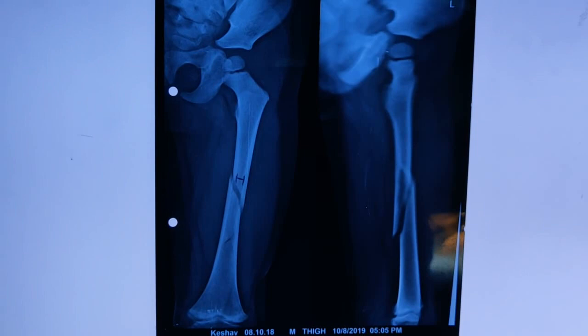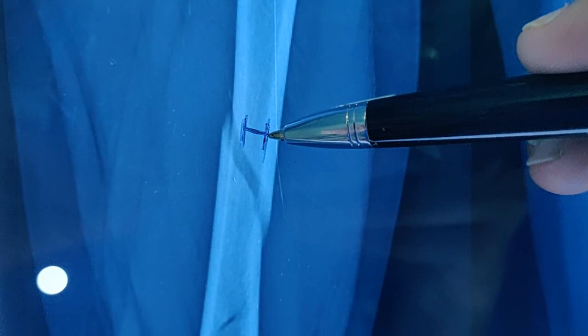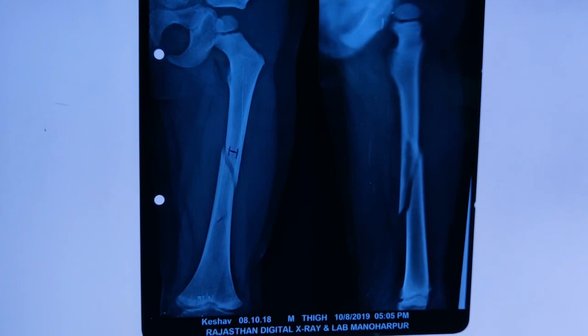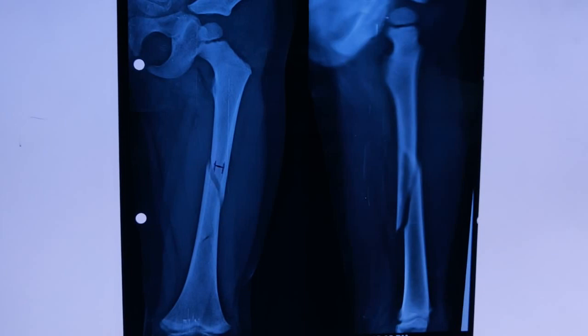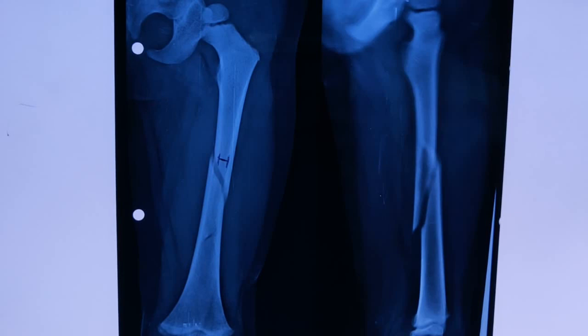One important thing when using a TENS nail is to determine the right size of nail to put. I have done some marking here — the inner aspect of the medial cortex and the inner aspect of the lateral cortex — giving the diameter of the cortex. If the diameter is 10mm and you are using two TENS nails, as is usual in long bone fractures such as femur or tibia, you use 0.4 × 10 = 4mm. So you use two nails of 4mm, filling around 80% of the canal. If it were 8mm, then 0.4 × 8 = 3.2mm, so roughly 3mm nails.